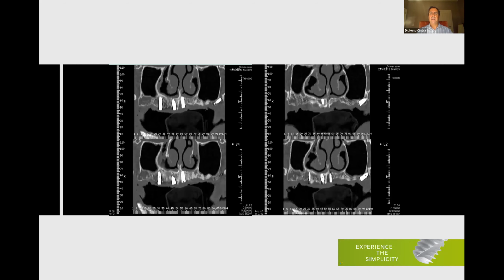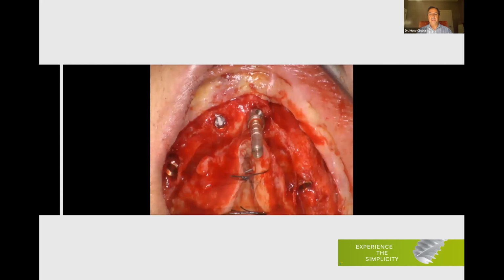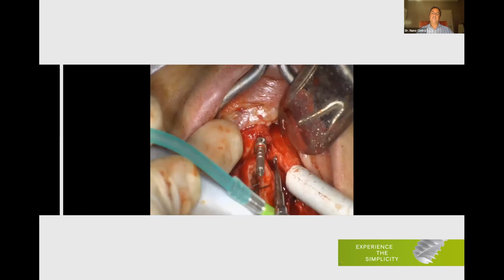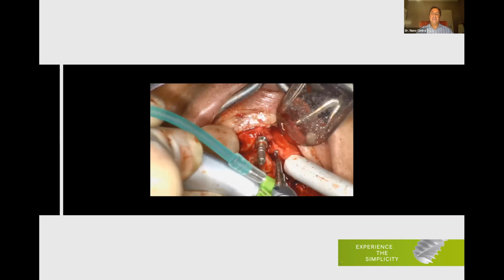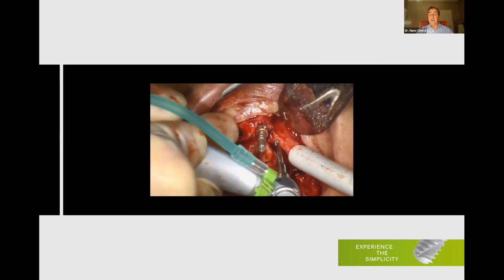We removed the implants, and although we have a lot of bone defects, as you can see here, mainly in the anterior region, at the back we can see the lesion of the pterygoid implant that was there. But anyway, we still have good bone available to do a standard procedure, a standard all-on-four. So we placed the 3 implants, and now we go for the anterior one, which is very close to that defect. And for this, I used a bioactive Alfa Gate 3.5 implant.